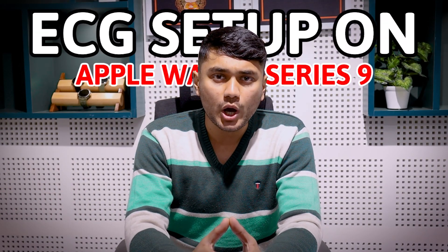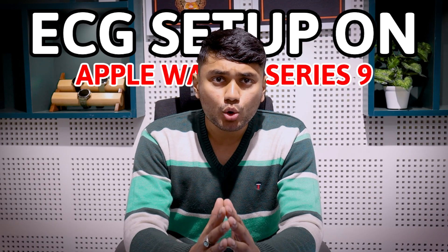In today's video, I will show you how to set up ECG on your Apple Watch Series 9. Not only that, I will also explain how to measure ECG and view recorded data.